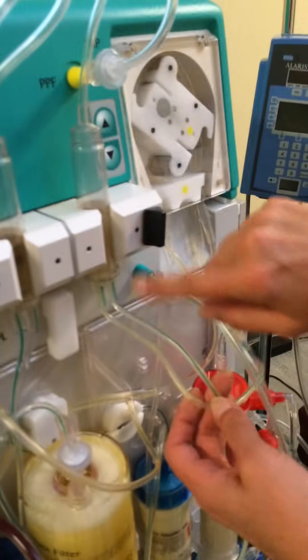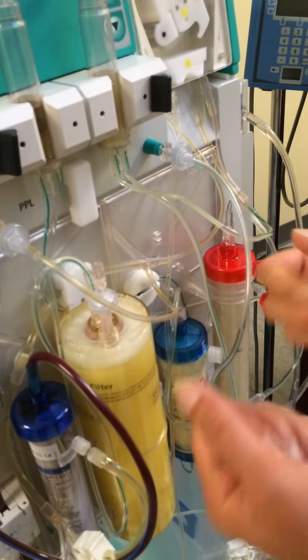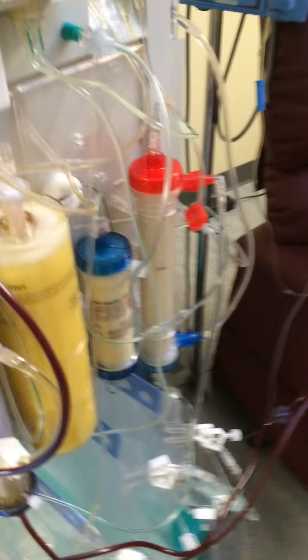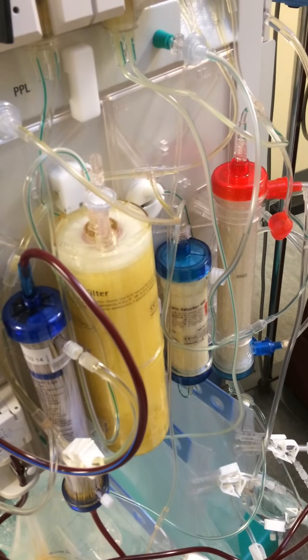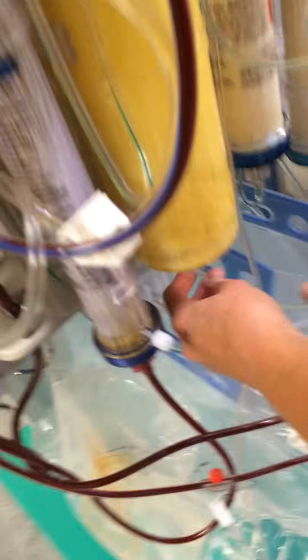The precipitate starts to occur here. As you can see, it starts to turn a yellow, milky color — that's precipitation occurring with the plasma. We want to remove that precipitate because it contains inflammatory factors, lipids, fibrinogen, and many other elements. That precipitate circulates down into the precipitate filter. A lot is being removed here. Inside the cylinder of this filter is where the precipitate remains.